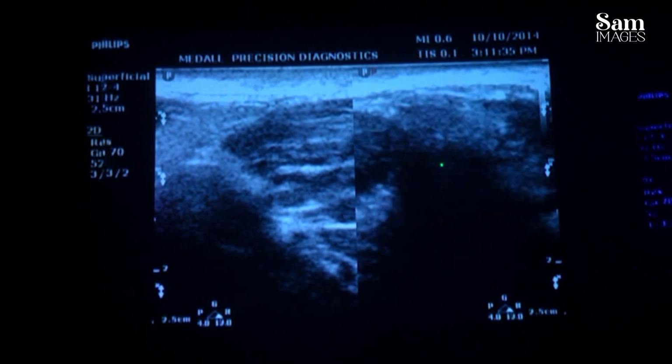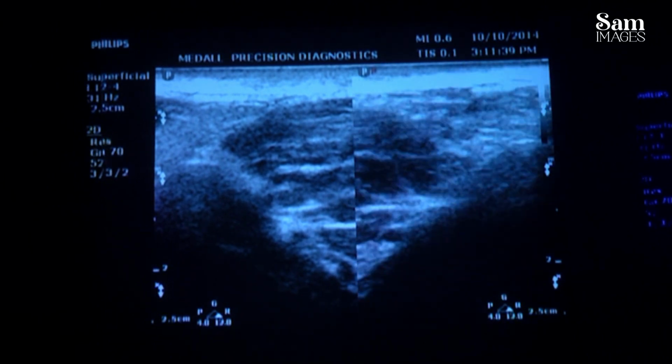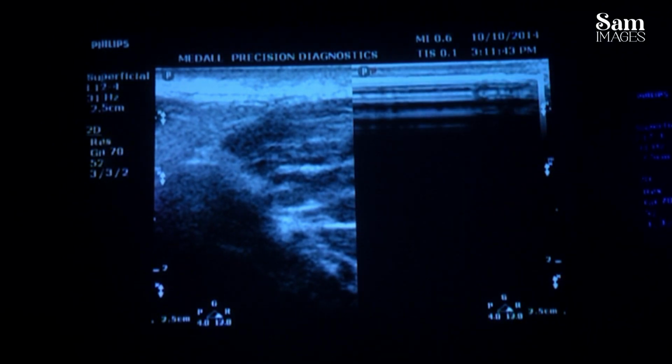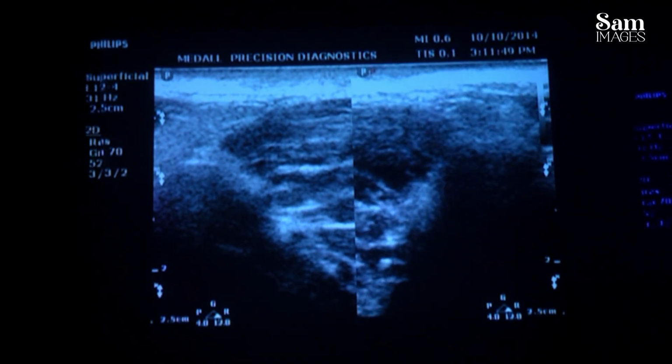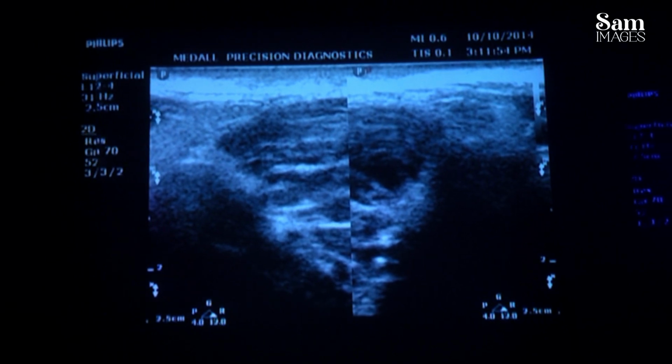You can see it is coming back to the mandibular fossa. You can see that one. So when that smooth movement is there, sometimes you might have experienced or seen that click sound, right? The articular disc has been eroded, a click sound will be there. So that is a clinical indication for doing this temporomandibular joint ultrasound.